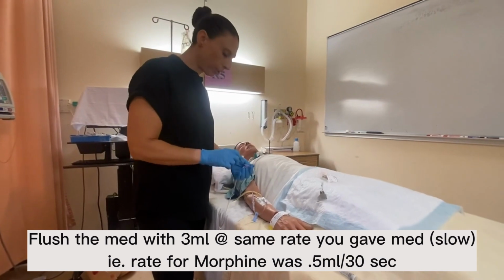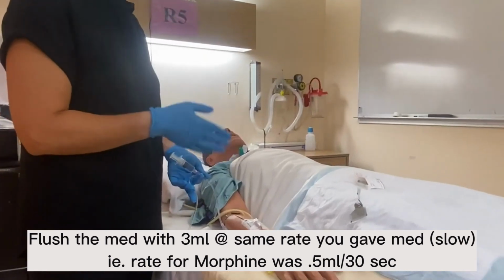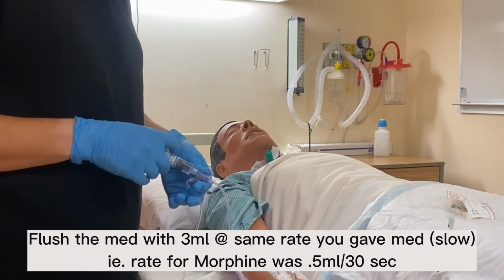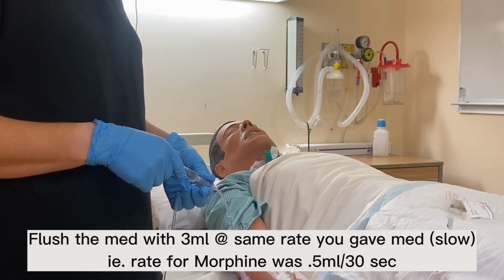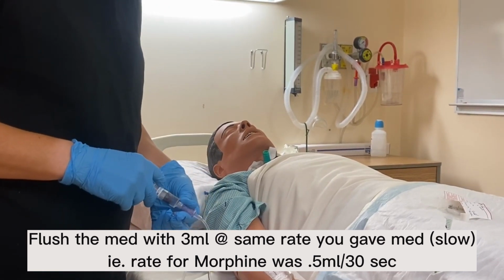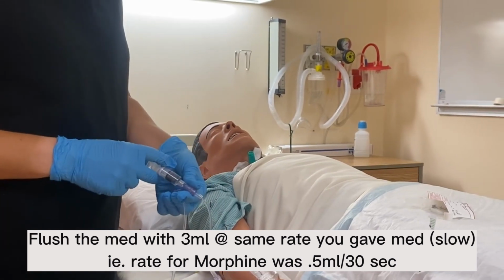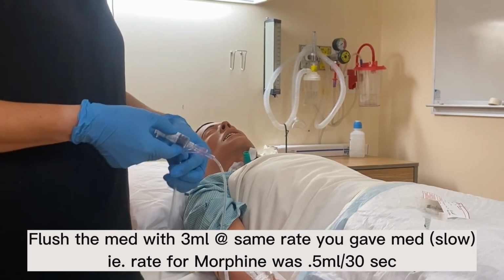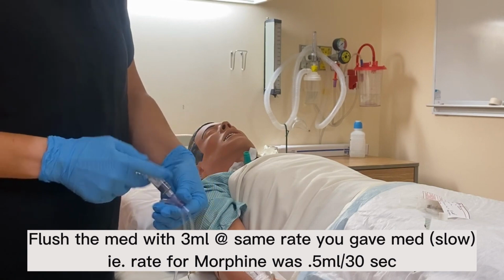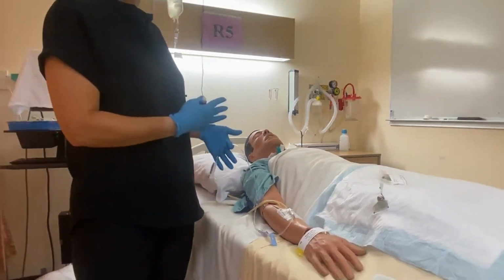Okay, so important thing, 3 mLs needs to go slow. So we have to do it at the exact same rate that we did the morphine. Okay, so again, 0.5 every 30 seconds. So I pushed 0.5, now I'm going to pause for 30 seconds and I'm watching the clock. Okay, and then again, 0.5. I'm pausing, watching the clock until the whole 3 mLs is in. Pause, 30 seconds, and then a push again. Okay, and then we can take that off, and we know that our medication has cleared the line.